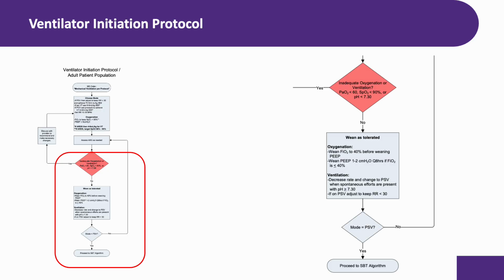So think of ventilator initiation as getting the patient stabilized and onto pressure support ventilation, and the SBT as the gateway to getting them off the ventilator entirely. Let us head there now.